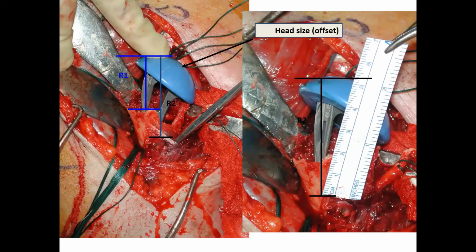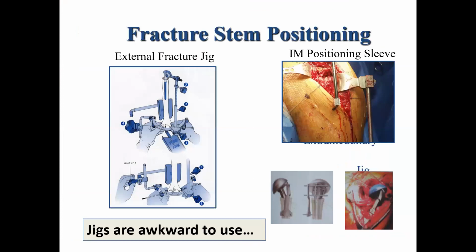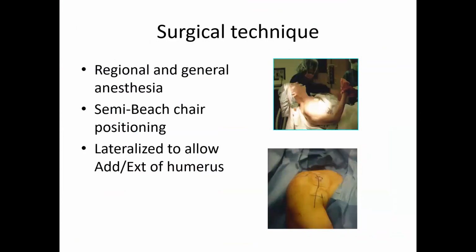So this is an intraoperative image showing a ruler that measures the distance between the upper border of the pec major and the top of the humeral head prosthesis, and should be, as I said, between 5 and 6 centimeter. This is a proper placement of the stem. I said before that there are many jigs and they are awkward to use. I don't use them usually.